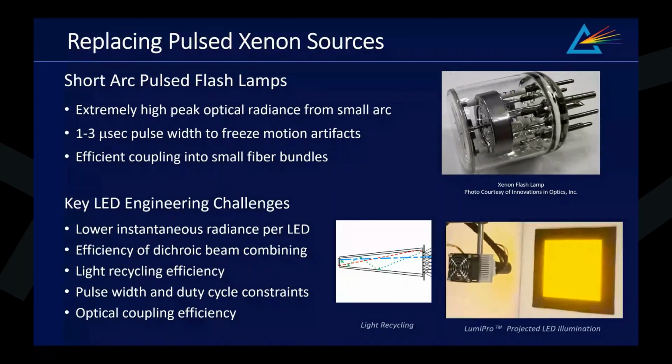Another challenge is reproducing broadband surgical white light illumination while simultaneously supporting fluorescence imaging and wavelength selective imaging modes within the same illumination system. Solid-state LED replacement of pulsed short arc lamps remains one of the most challenging applications. Only through combining all the technical advancements at our disposal, including overdriving LEDs, patented light recycling, optimized optical systems to efficiently combine multiple wavelengths into the fixed étendue of the fiber bundle, thermal management, and high-speed, high-current drivers, are we only recently able to start to approach the performance of pulsed short arc lamps for some applications.